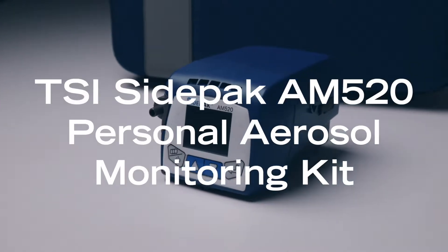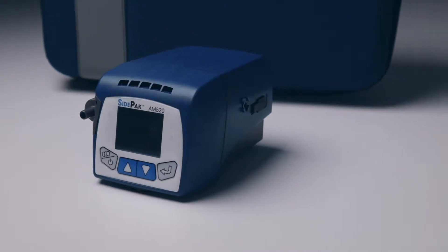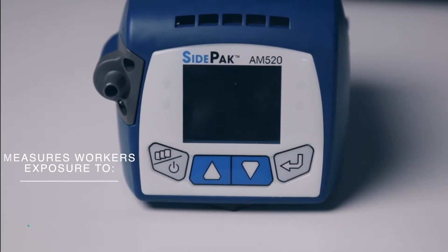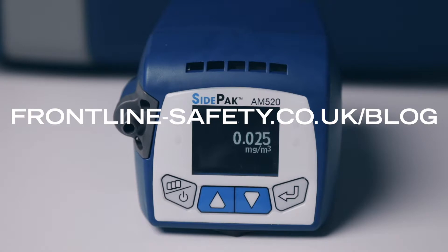The SidePak AM520 is a personal aerosol monitor from TSI, designed to measure workers' exposure to respirable dust, silica and diesel particulate matter. We're going to cover some of the features and benefits of the SidePak in this video, and more information can be found on our blog.